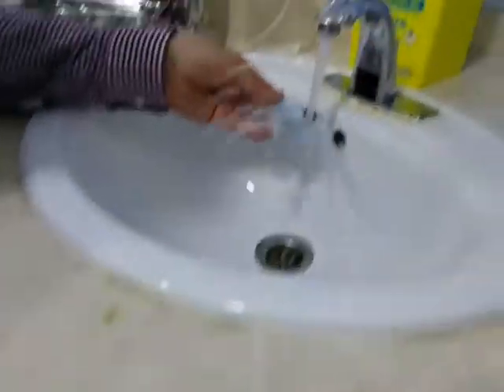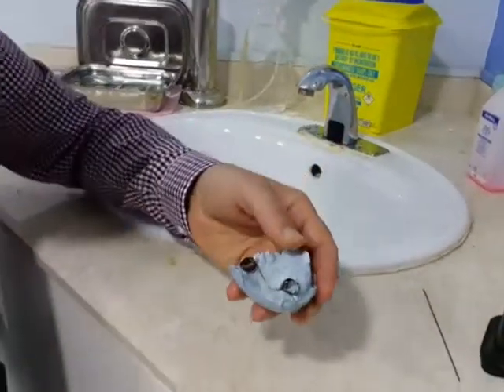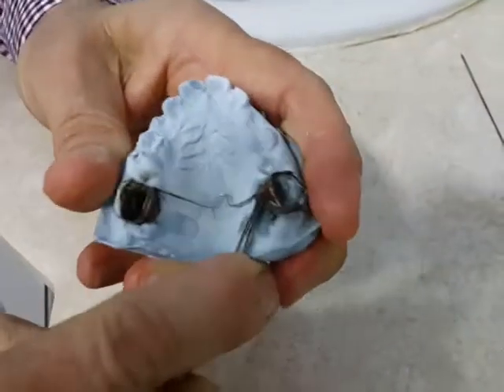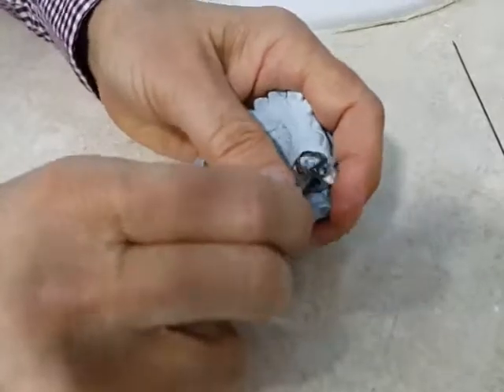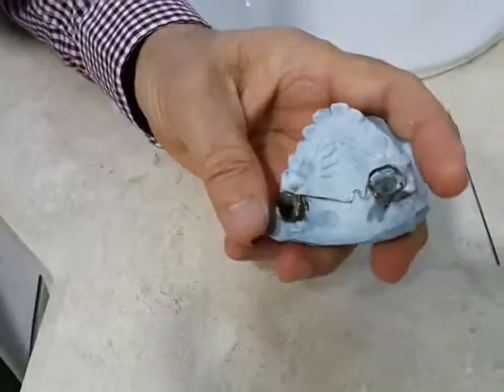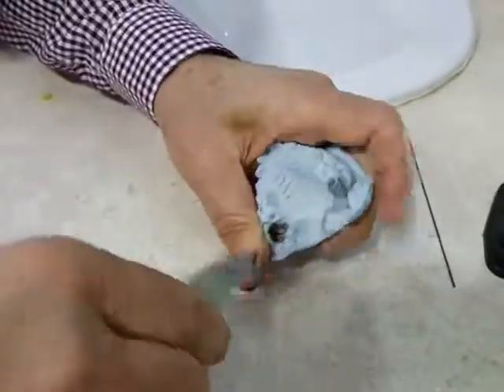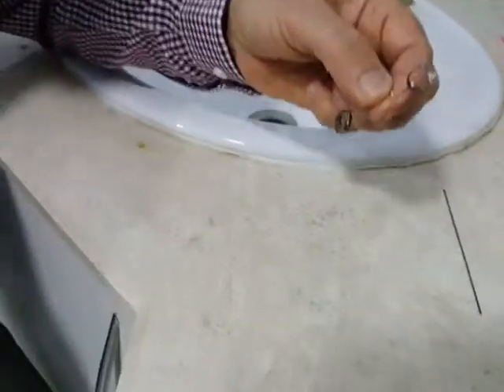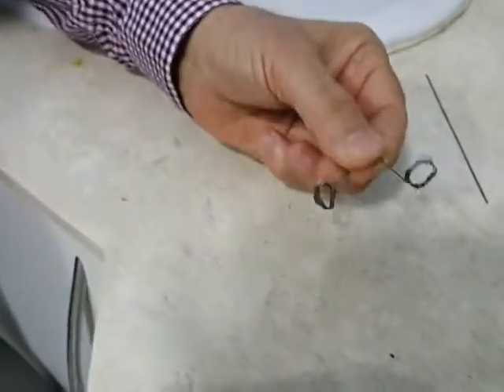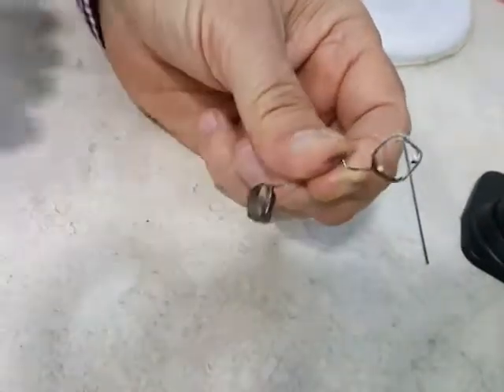Cool the material or put it in tap water. Now the soldering has been done and the palatal arch is ready to be taken out. The palatal arch is ready now, but it requires polishing and finishing in the soldering area.